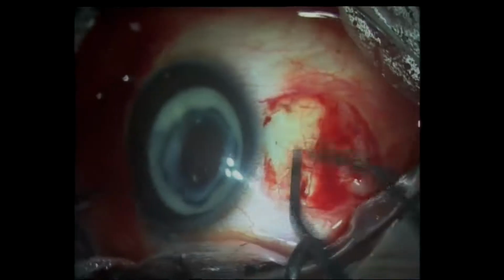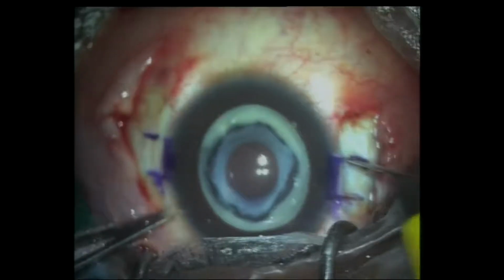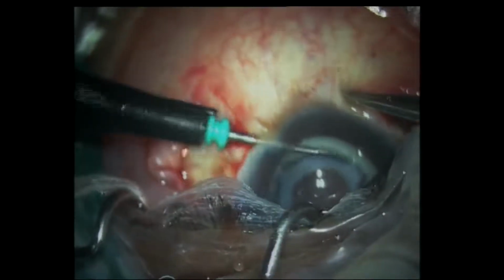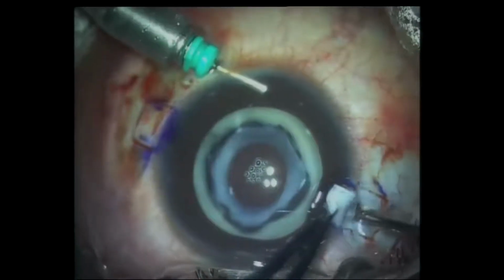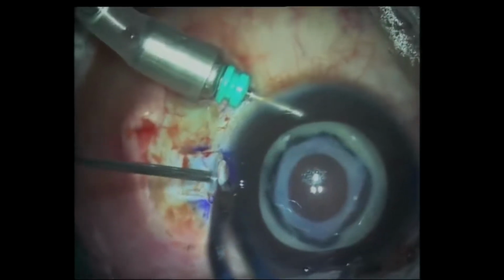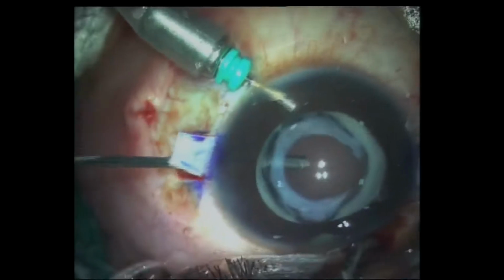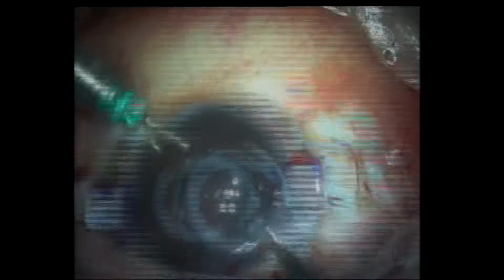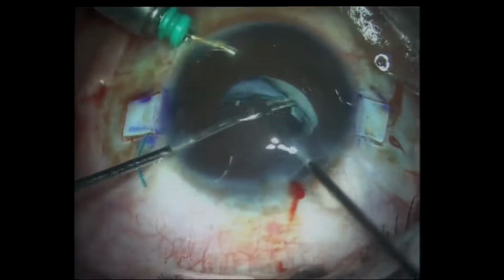here I'm making my scleral flaps. Once I've made my scleral flaps, here's 2 by 2 millimeters. I put an AC maintainer, but I put a trocar AC maintainer, which gives me a self-sealing wound and continuous infusion of fluid inside. I've made my entries, my sclerotomies, as well as done my anterior vitrectomy, which in these cases, more often than not, you don't really need, but it's always good to have an anterior vitrectomy done in these cases. Push in your foldable intraocular lens.